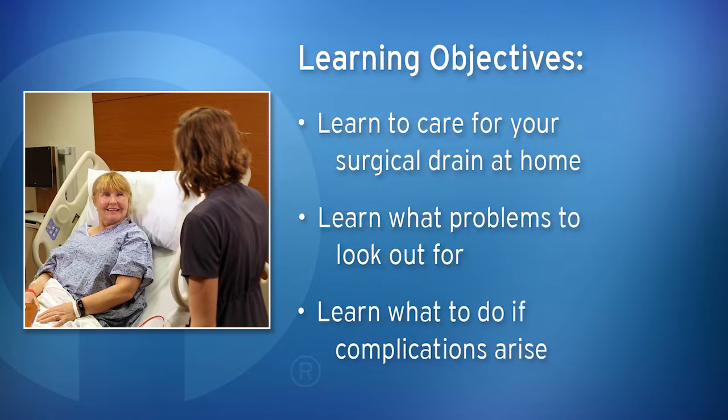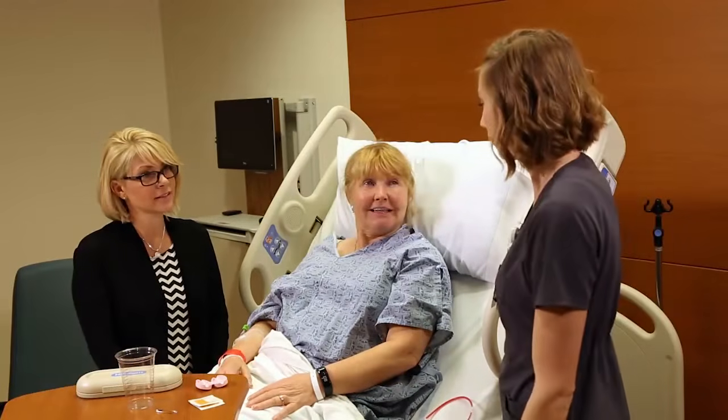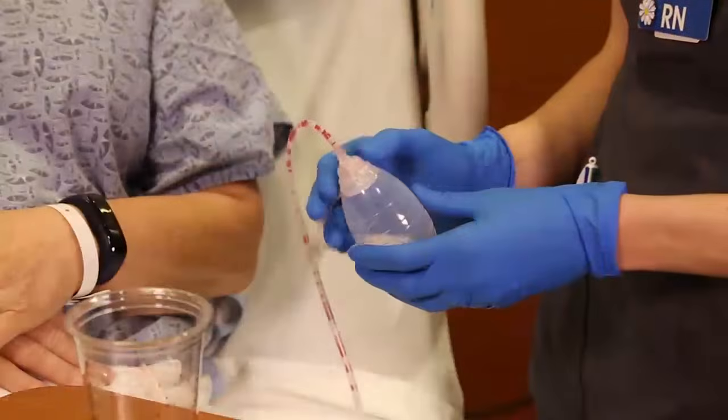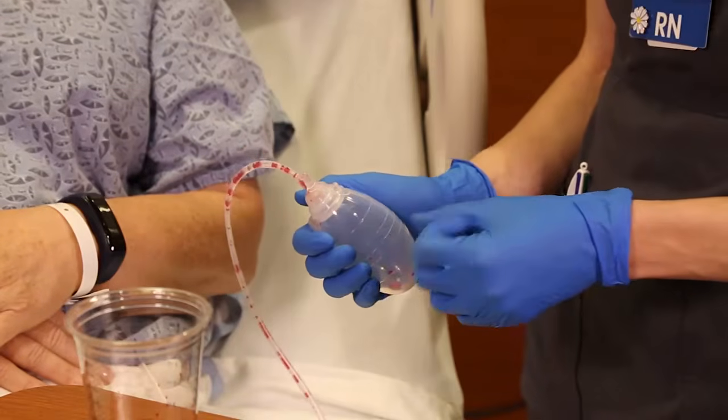do should complications arise. Good morning, Mrs. Smith. I'm here to teach you how to take care of your surgical drain. Do you remember the purpose of your surgical drain? Yes, it prevents fluid from building up and allows tissue to heal.